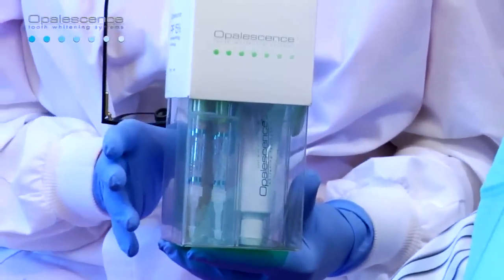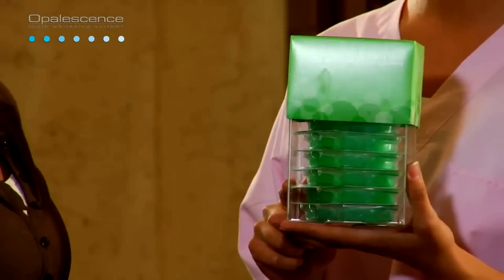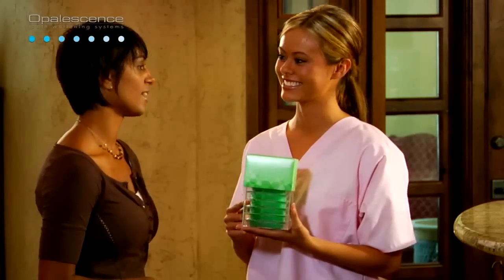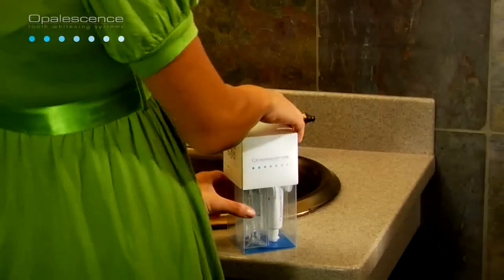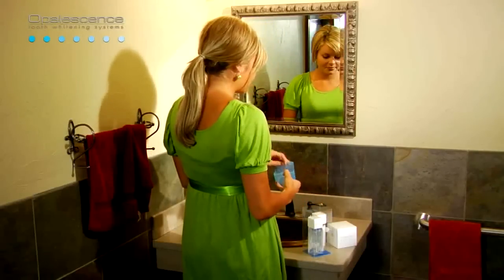Be certain to read the product instructions, warnings, and information for the patient contained in the package, and advise the patient accordingly. Doctors continue to report growth in the custom whitening category as more patients are becoming aware of their smiles and want whiter teeth. According to recent data, home whitening kits are used only by 15% of consumers, indicating ample opportunity for sales growth and deeper penetration of the market. Almost half of surveyed dentists who dispense take-home whitening kits report an increased demand for professionally dispensed take-home whitening kits.